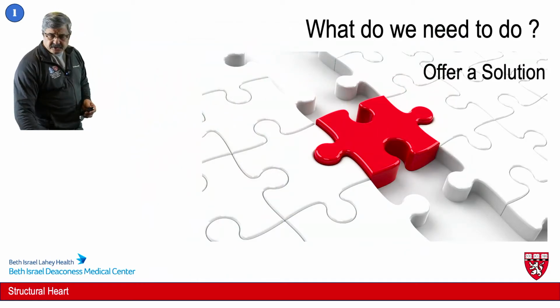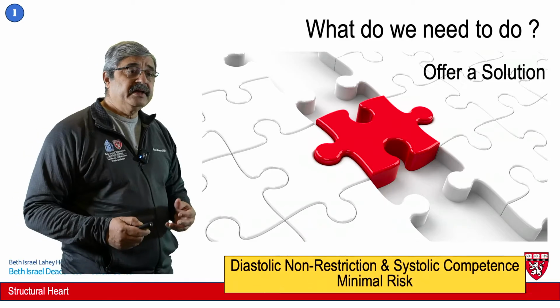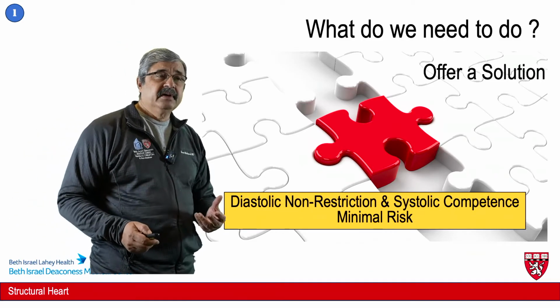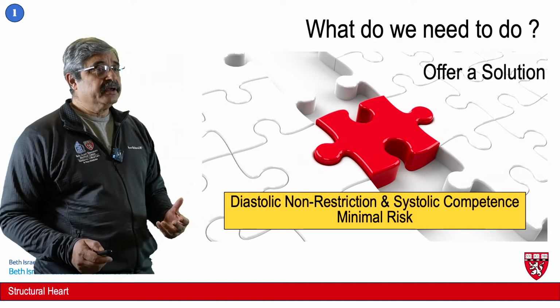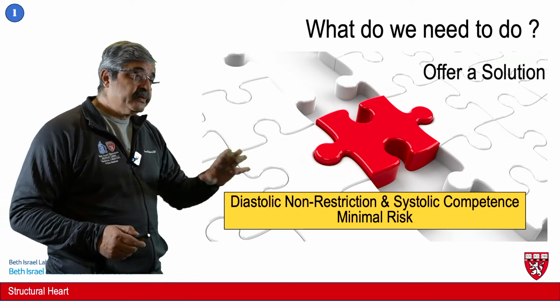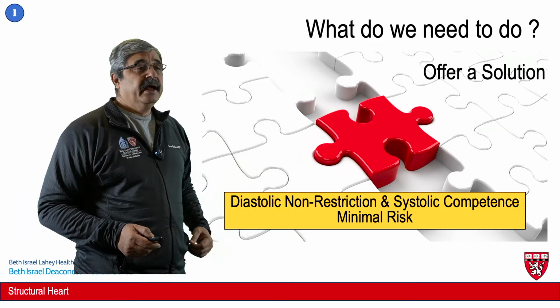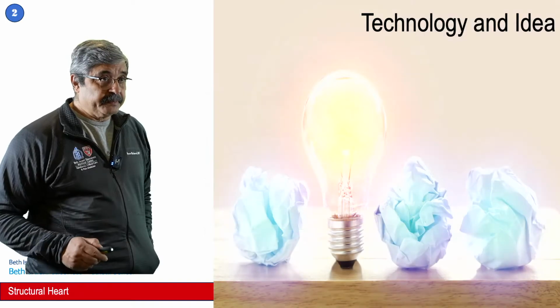So what do we need to do when we get to this point? We need to provide a solution, that is, to have a mitral valve which is diastolically non-restrictive and systolically competent, in a process which is of minimal risk and does not add to the risk of patients who already have so many other comorbidities and are considered prohibitive risk for surgery.